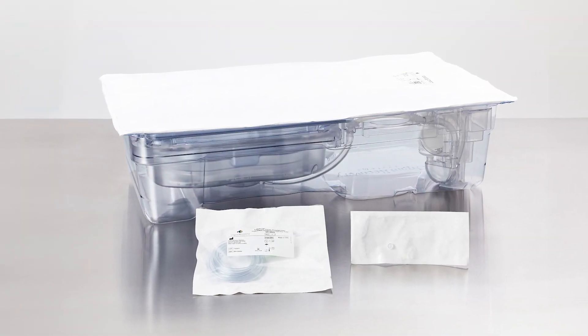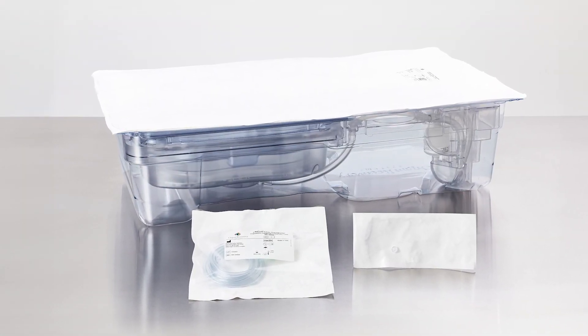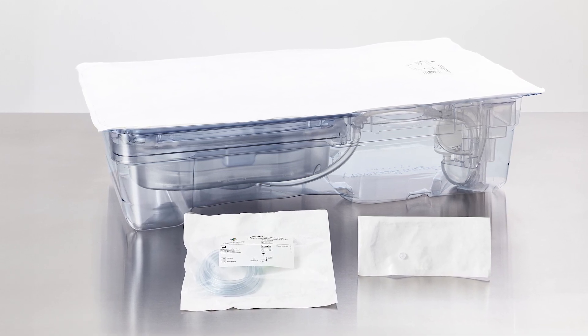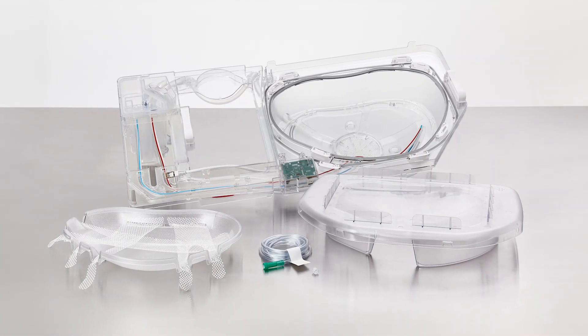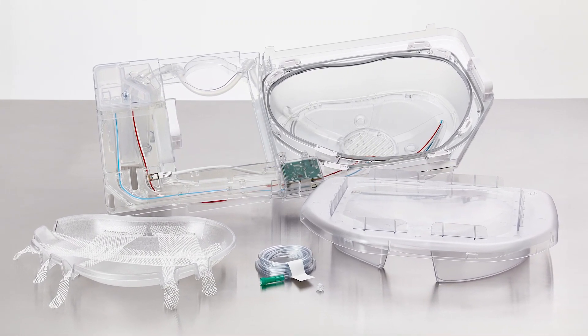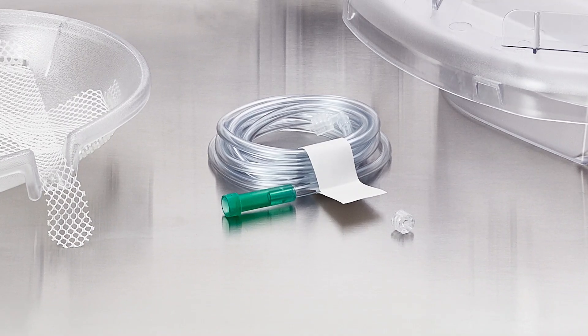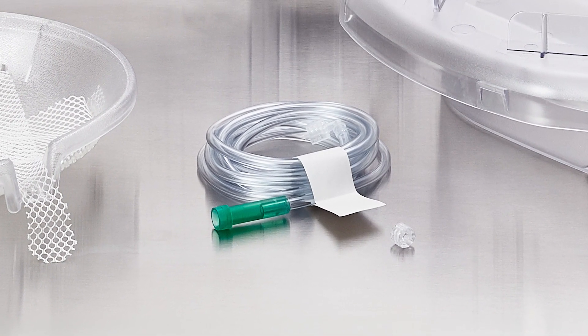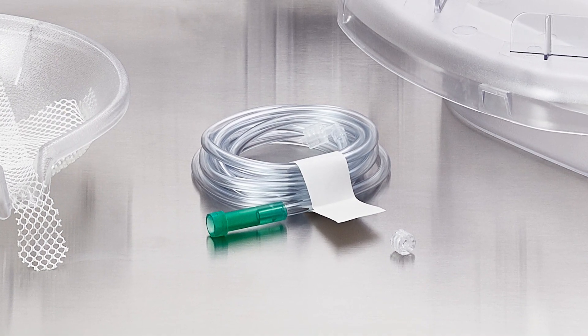Place the individually packaged perfusion circuit oxygenation delivery tube and lure lock cap onto a non-sterile table. Using standard aseptic technique, prepare a sterile field and introduce all necessary materials. Using standard aseptic technique, remove the oxygenation delivery tube and the lure lock cap from their packaging and place onto the sterile field.